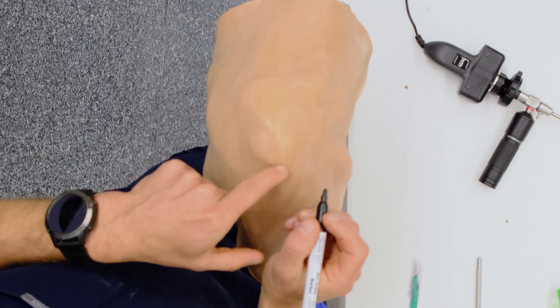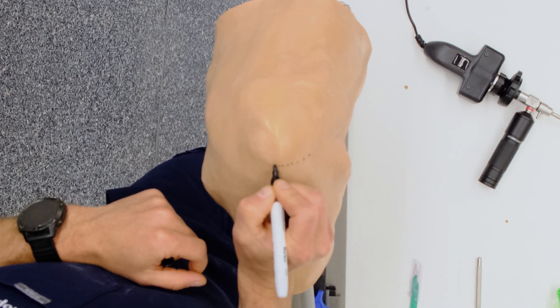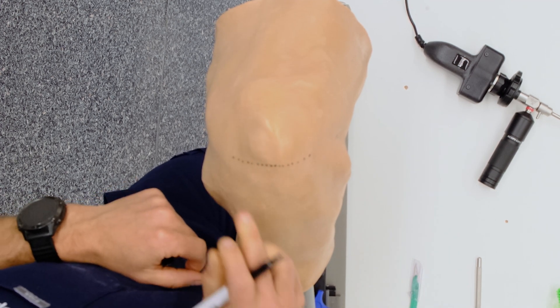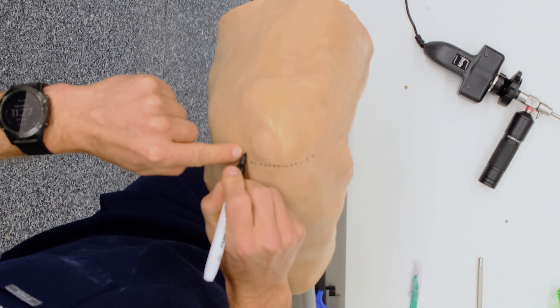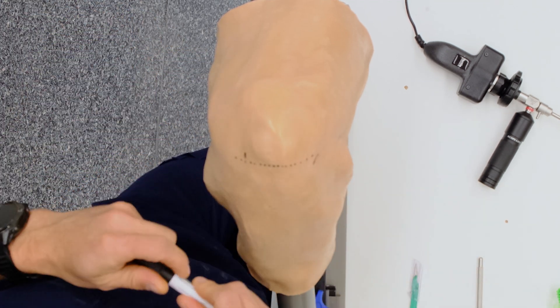I'm going to build my portal landmarking. I like to mark things out with a marker beforehand. I like to put a line on the inferior pole of the patella. I'm a fan of and quite often use a high anterolateral portal and then an oblique low anteromedial portal.